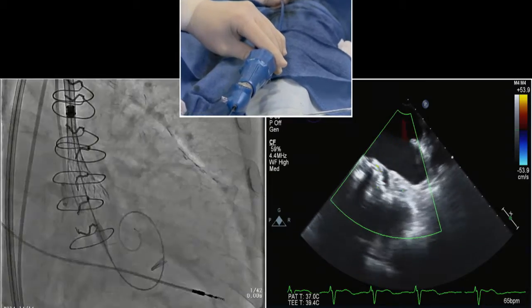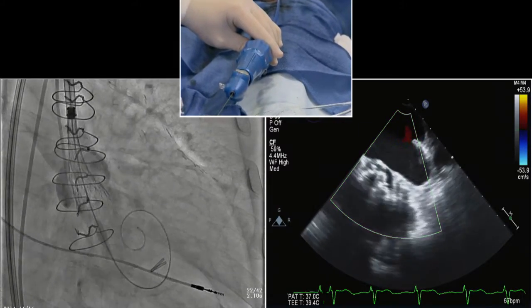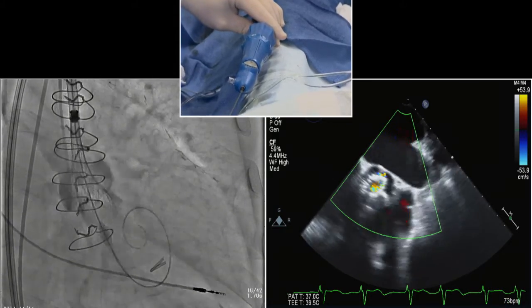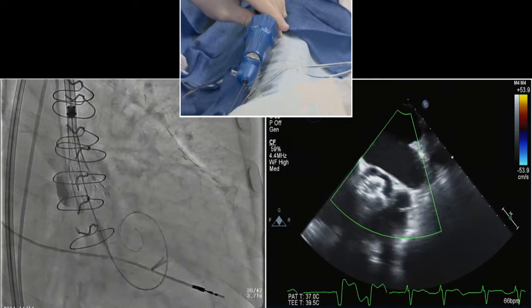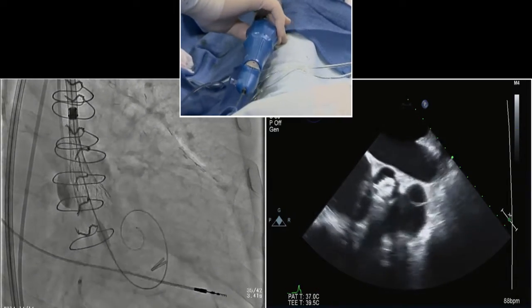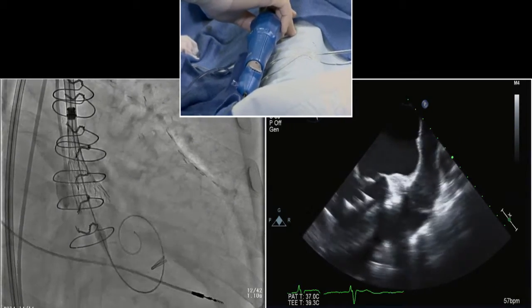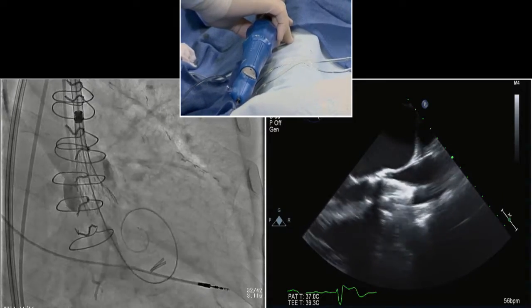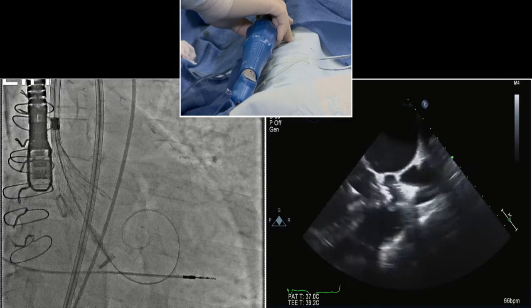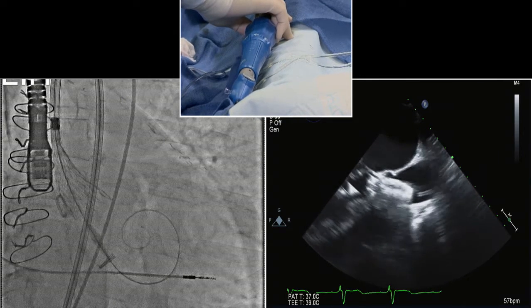I guess the important decision-making process here is to decide if you are going to release the valve and post-dilate after, or you're not going to accept that and then pre-dilate to come back with this valve, because it's a fully recapturable valve. Nico, do you want to say something? Yeah, it's Nico. We have time and the patient's stable, I presume.